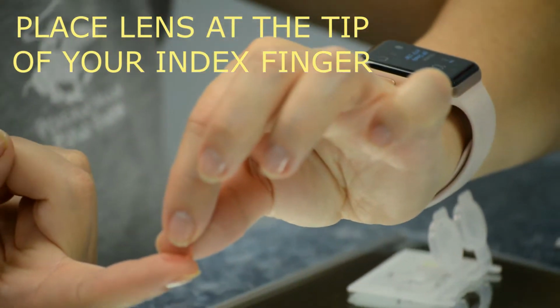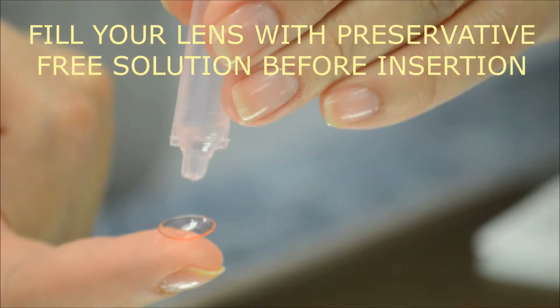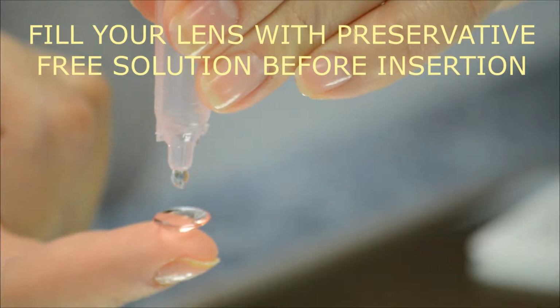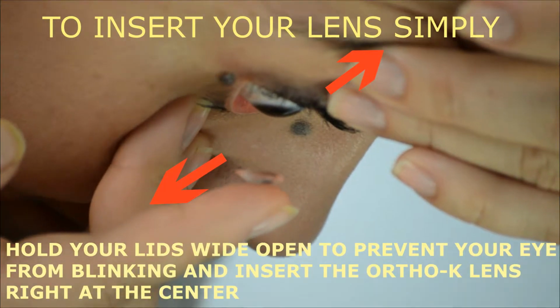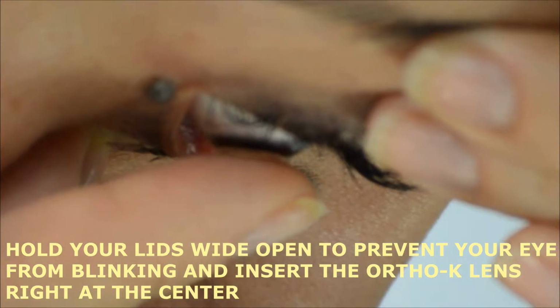Now, to insert your Ortho-K lenses, start with your right lens. Place it at the tip of your index finger and fill it with the preservative-free solution prescribed by your doctor before insertion. Now, hold your lids wide open and hold them tightly to prevent your eye from blinking. And now, insert the Ortho-K lens right at the center of your eye.